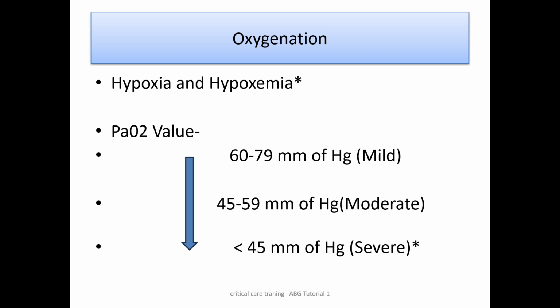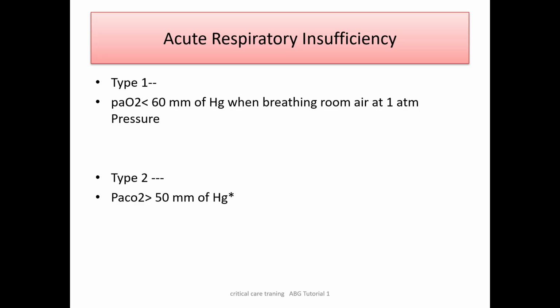And if you see long term cyanotic heart disease patients or people who have climbed mountains like Everest, if you take their ABG, you will find low PO2 without any lactic acidosis. So this is all about the time, duration, and clinical context. That is what is important when you are interpreting and treating these patients in the ICU.